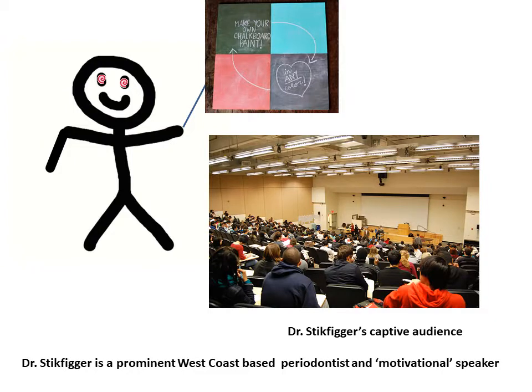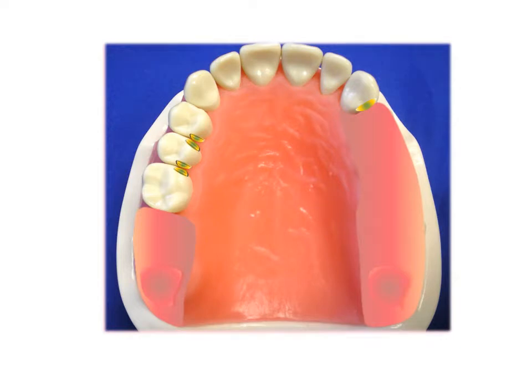Okay, when do we survey the diagnostic cast? First, we'll place our maxillary diagnostic cast on the survey table with the occlusal plane level to the table. Then we'll use our analyzing rod to examine the cast for potential guiding planes, locate and measure areas suitable for retention, locate interferences to the path of insertion, determine areas of recontouring, and determine the most favorable path of placement. After we do all this, we'll mark our heights of contour and tripod our cast. Of course, we should not neglect to examine for aesthetics, especially dark triangles and clasp location.